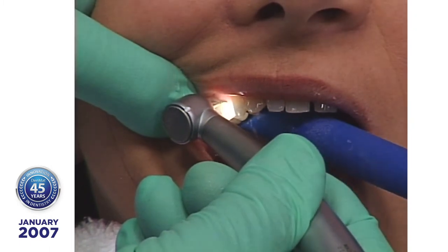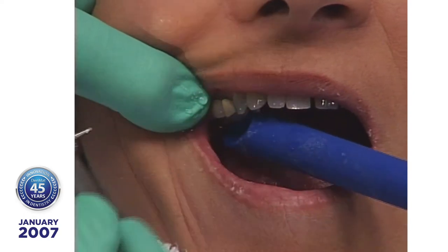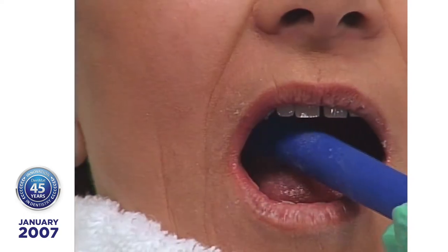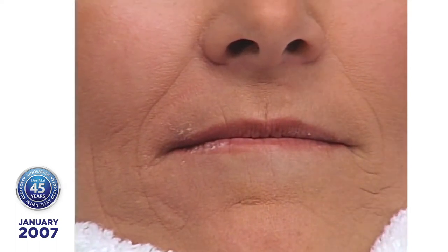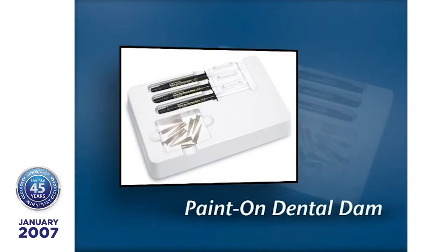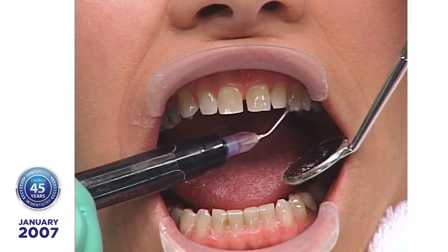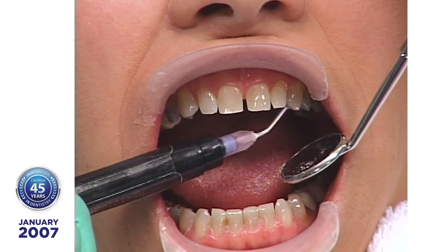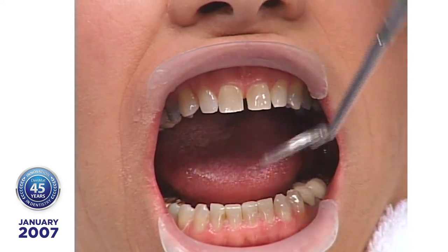What I want to do is get the metal away from behind the porcelain. When I create a trough, I can put an opaquer in there and mask that dark discoloration. The next thing we're going to do is simplify this whole process and put on paint-on dental dam. It looks like I'm injecting something, but it's really paint-on dental dam that we use when we do chairside whitening, and we put this on the lingual side of the teeth.